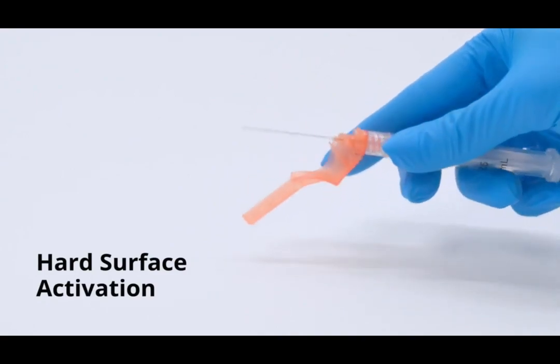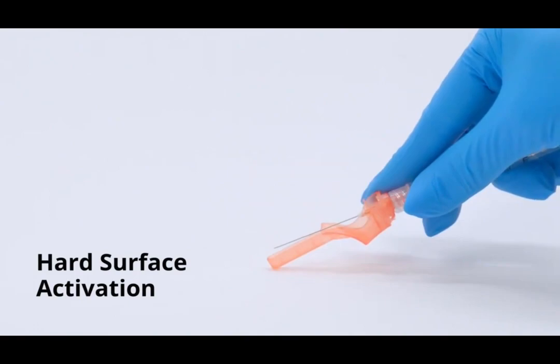Turn the syringe over and position the sheath at the lowest possible angle to the flat surface. Then push down with a firm, quick motion until a distinct audible click is heard.